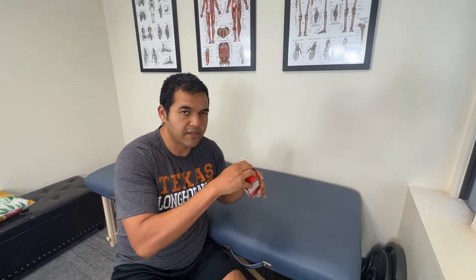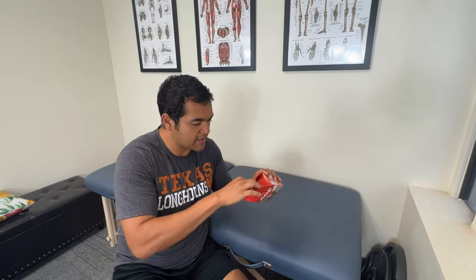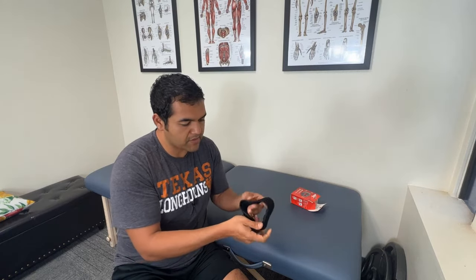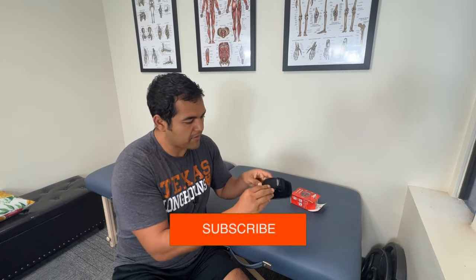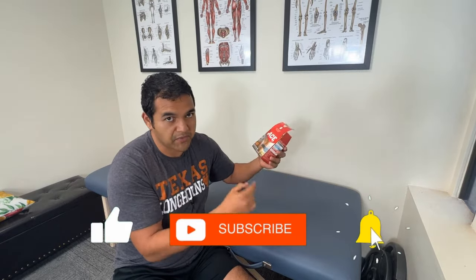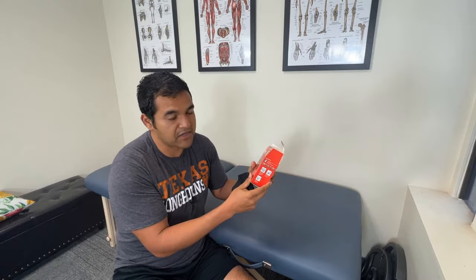This is a strap that goes around your knee and it's marketed for use with runners, people that are running or that are in running sports. It's just a simple strap — that's all that's in the box, by the way. There are no other instructions. It's a pretty straightforward device. You just strap it onto your knee.